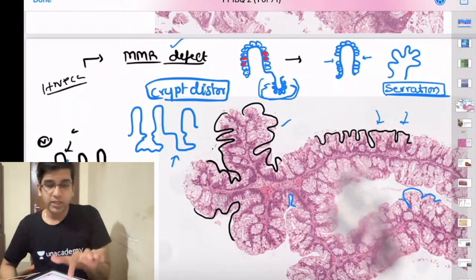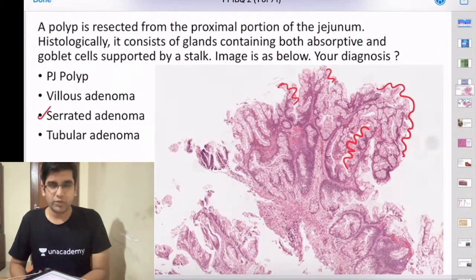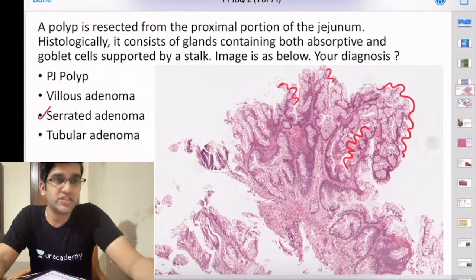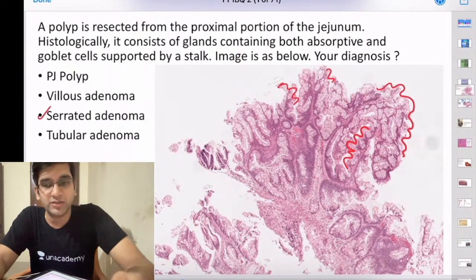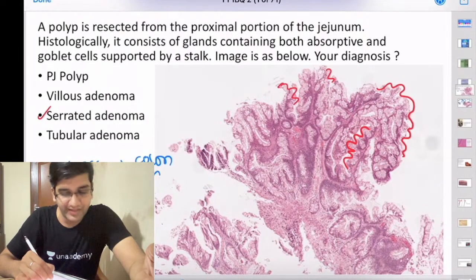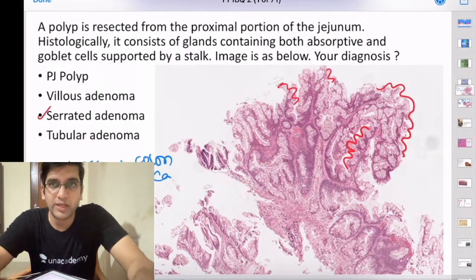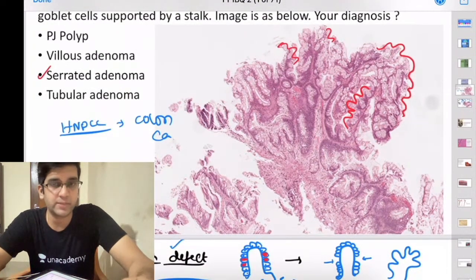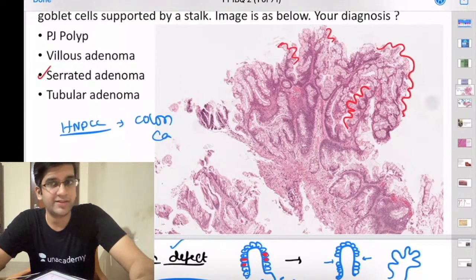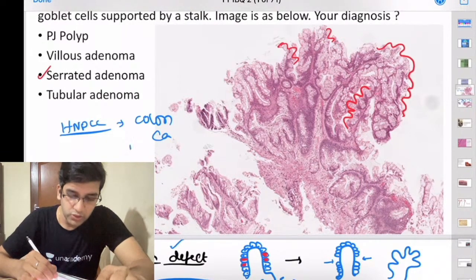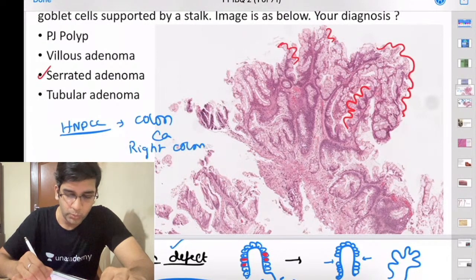In this image, the crypt distortion and villus serrations confirm serrated adenoma. Now extrapolating to right-sided versus left-sided colonic lesions: HNPCC-related colon cancer occurs in the right side of the colon. The APC/beta-catenin pathway causes left-sided cancers. HNPCC-related cancer is most common in the right-sided colon — the ascending colon and half of the transverse colon.